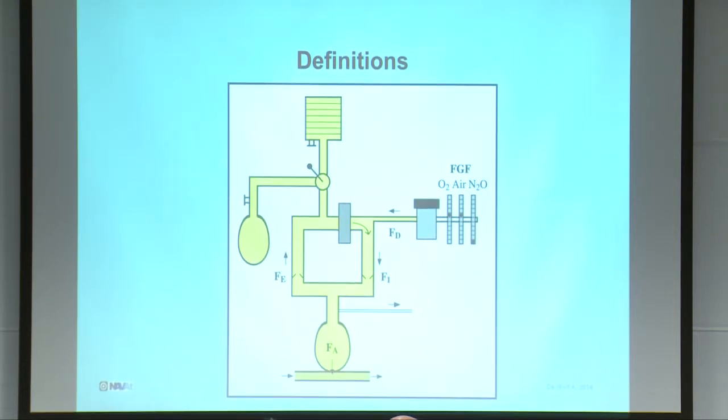Very big difference there because of the effect of rebreathing. And with lower fresh gas flow, we have rebreathing of exhaled gases. And that's not just true for the potent inhaled anesthetics in the exhaled gases, but it's also true for the carrier gases, oxygen, nitrous oxide, and nitrogen, air.